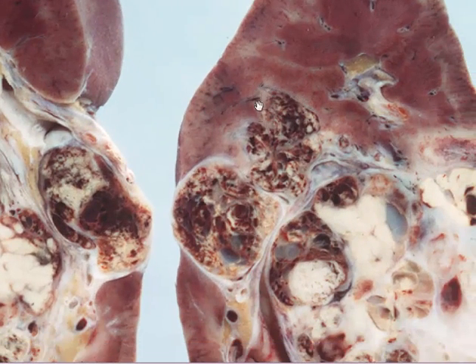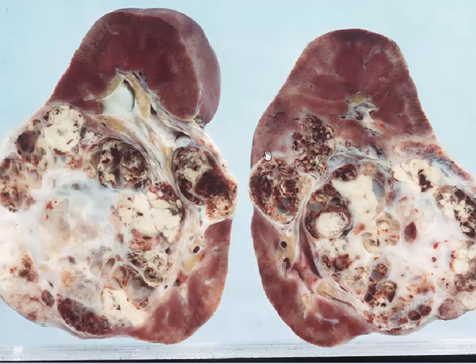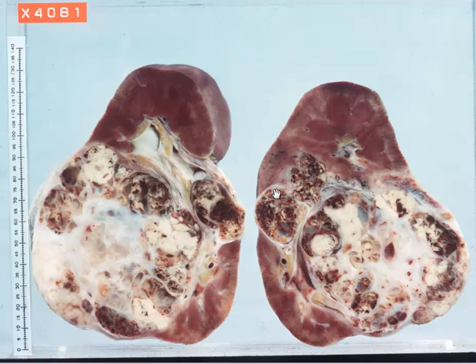Zoom in a bit, we can see quite clearly these masses of tumour that are destroying tissue. So this is a malignant neoplasm, and in fact it's arisen from the epithelium of the kidney, and therefore it's a carcinoma, a renal cell cancer.